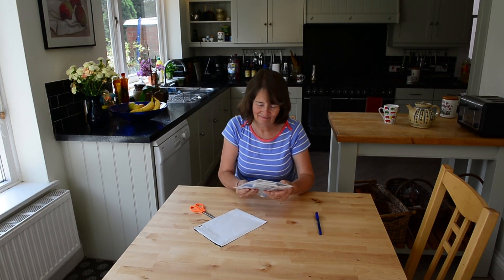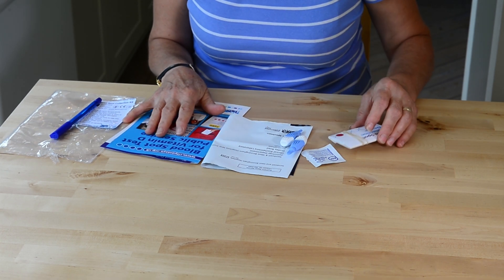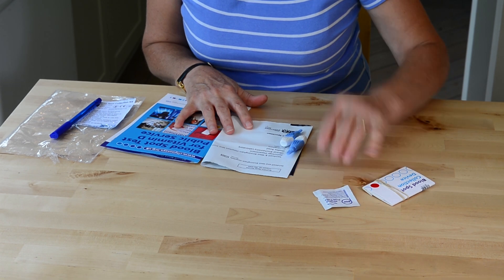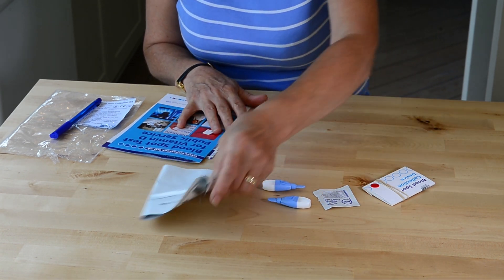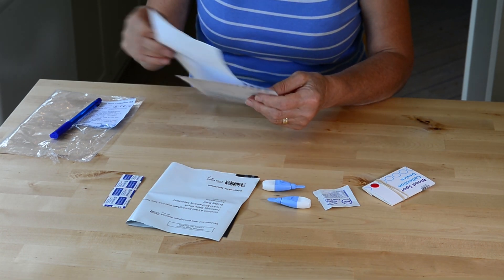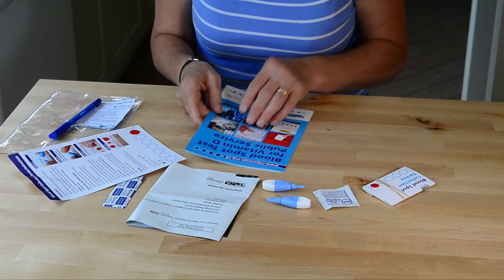Here we are in Barbara's kitchen. You will see that the kit contains seven components: a blood spot collection card, an alcohol wipe, two single-use lancets, a prepaid envelope, a plaster, and finally a consent form and also an instruction leaflet.